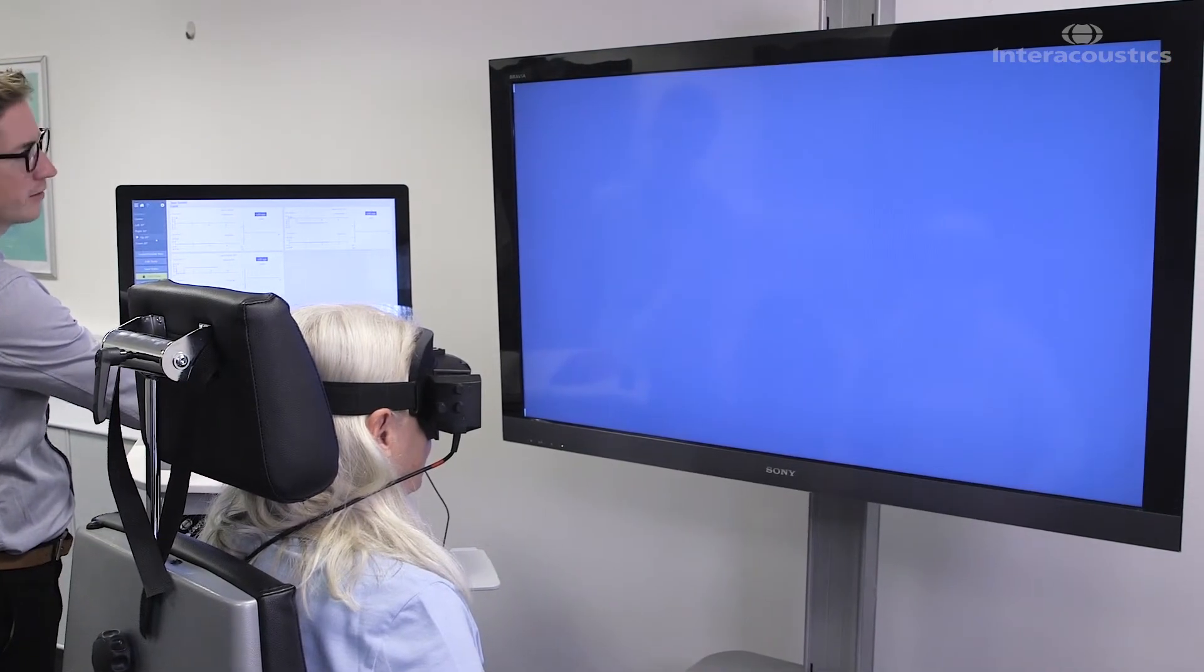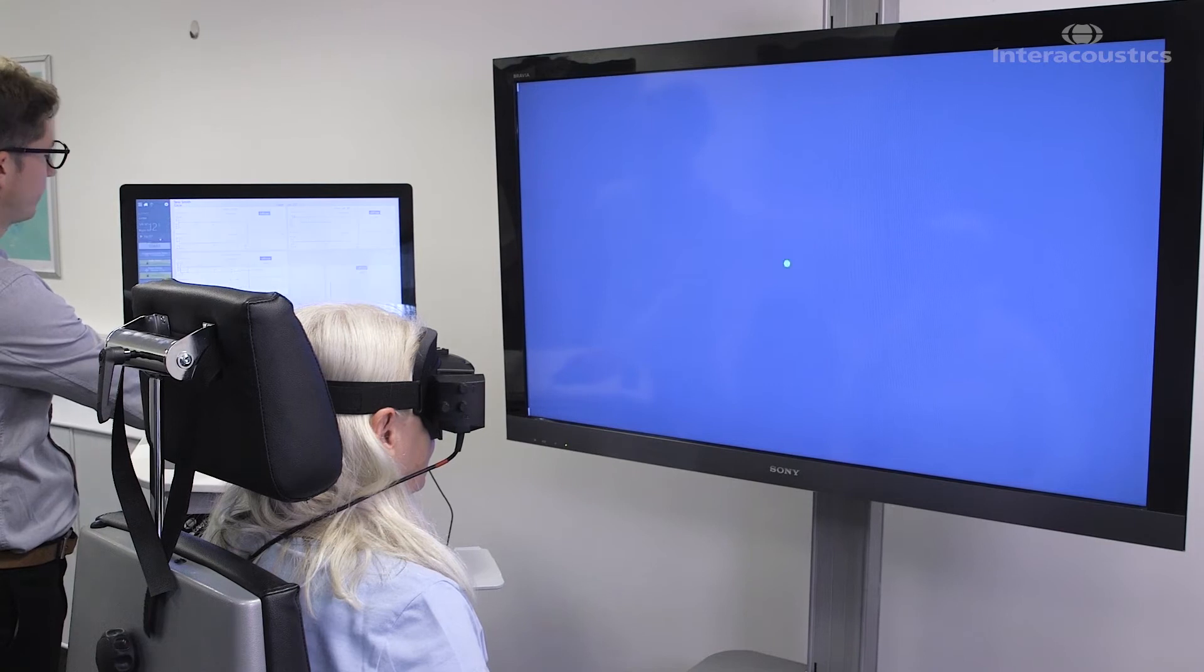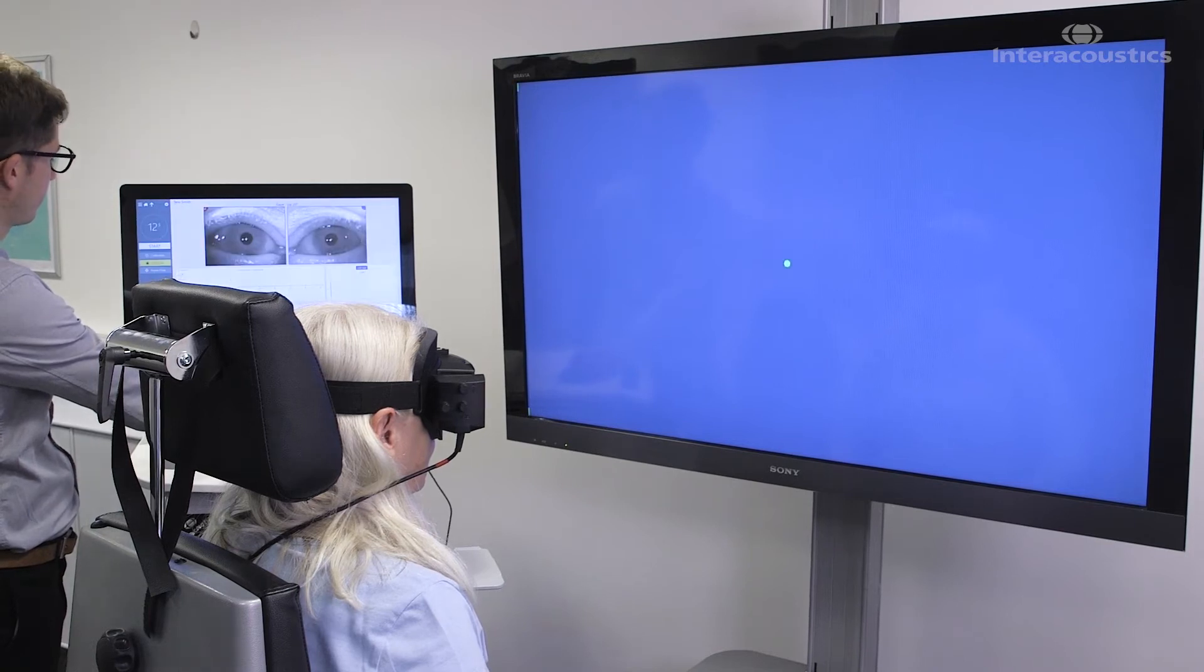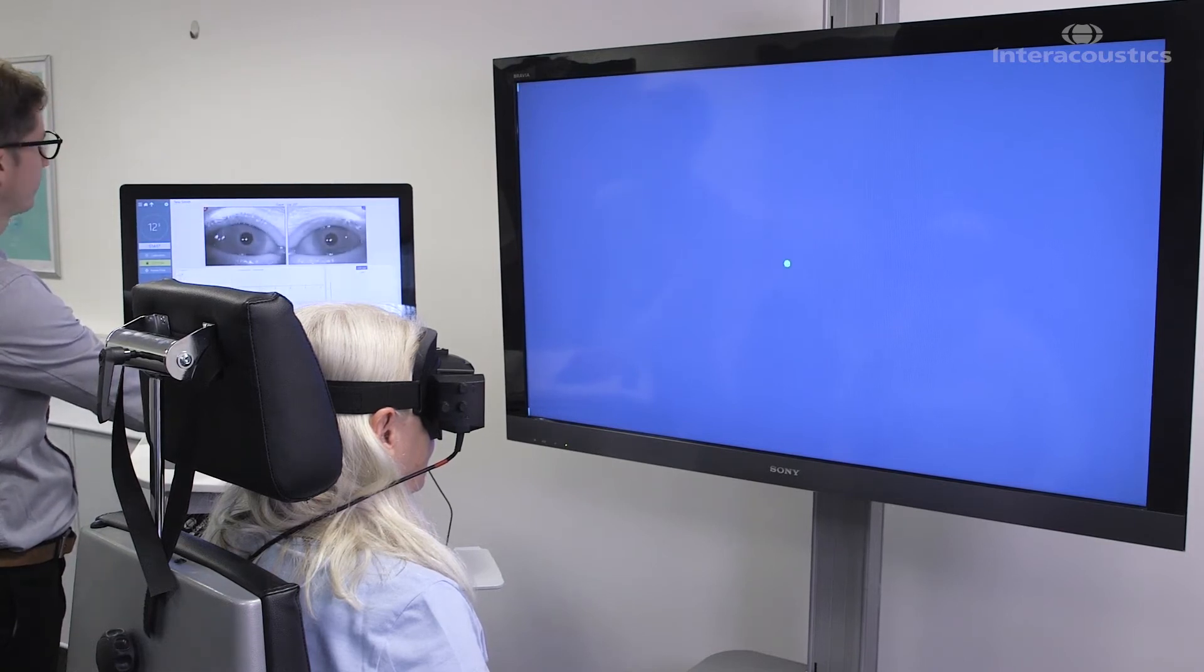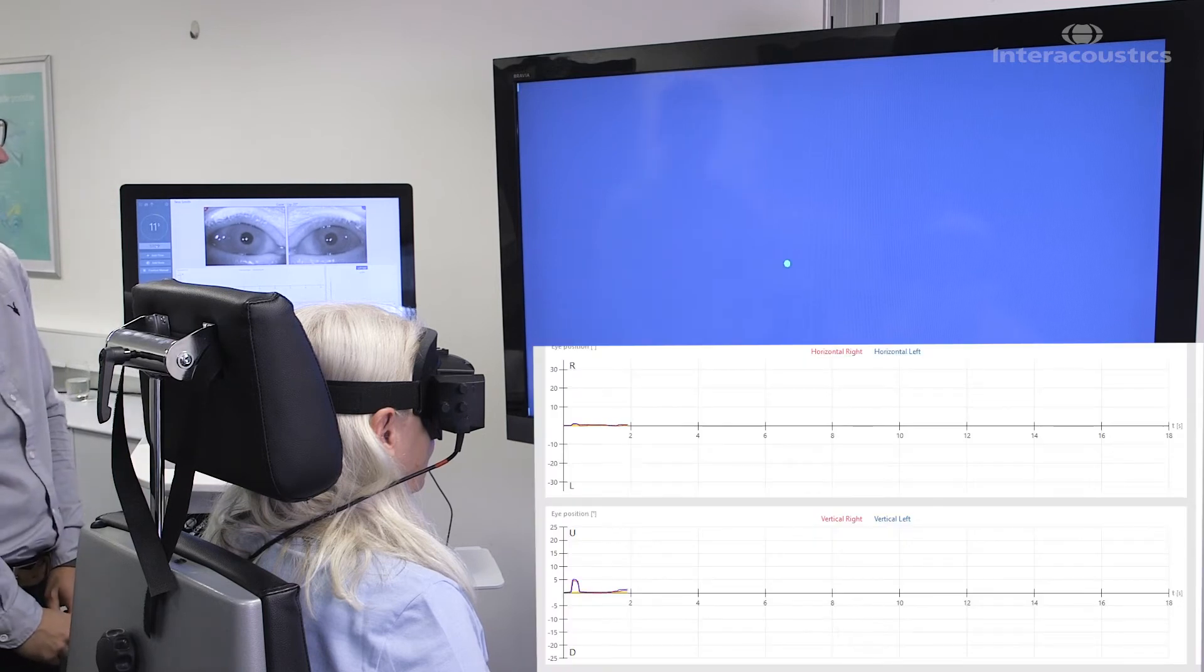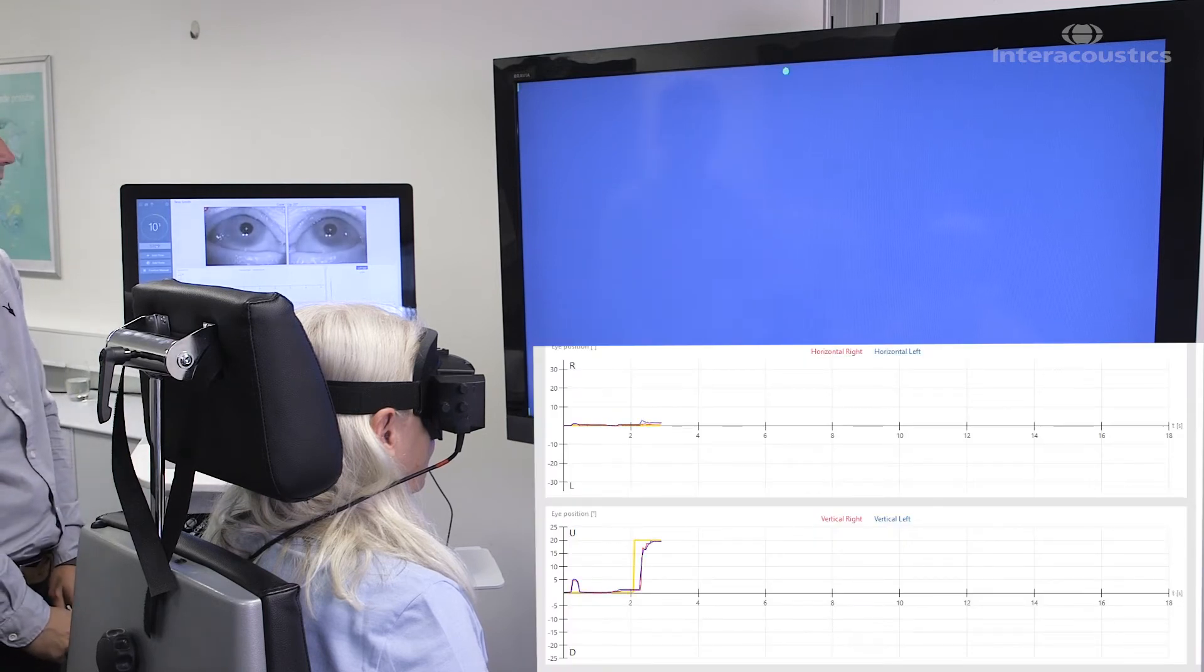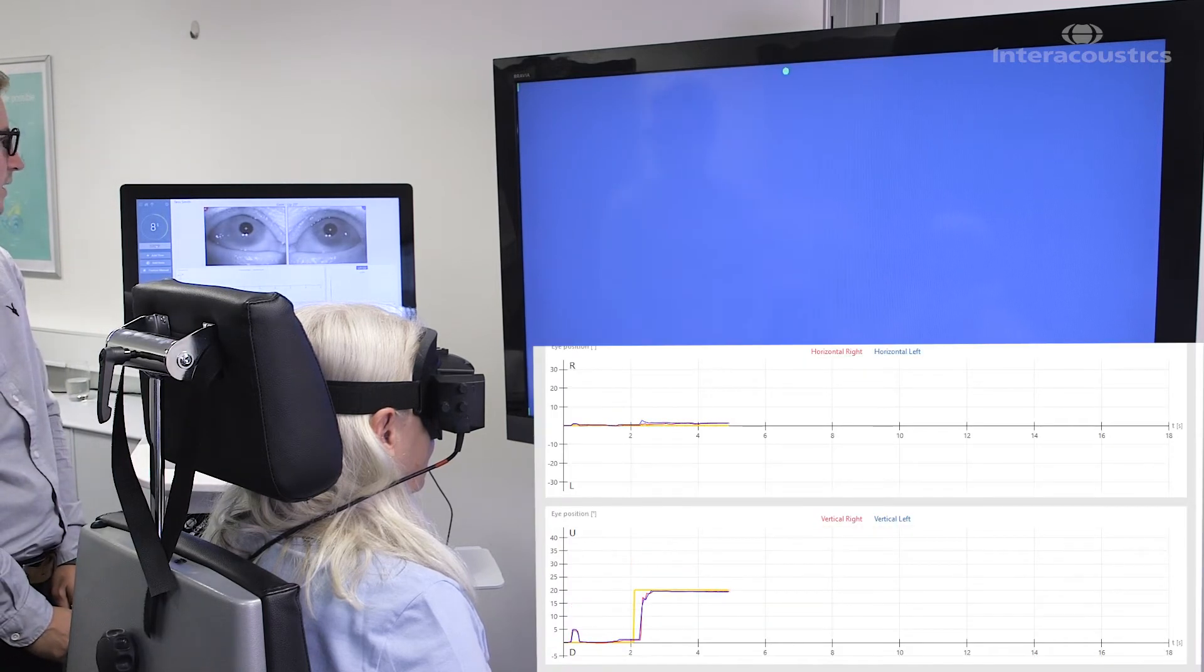What we're going to do now is to make the target move upwards. So here we go looking at the center dot. Counting down from 12. Fantastic.